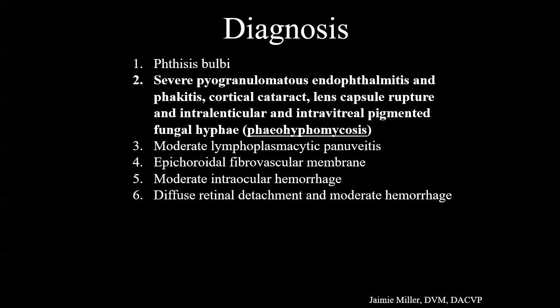which I did offer to them in case it might be helpful, which Florida has a PCR that we will send to, and it's dependent on how many fungal organisms in general you have in there, if they are able to catch it. And also the length of formalin fixation before paraffinization might degrade some things with further PCR. And then again, it would only identify the genus of the fungus. It won't give any sensitivity results or anything like that for treatment, but just extra pieces of the puzzle to help potentially.